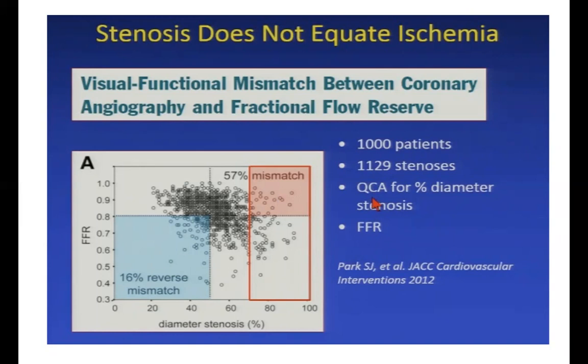How does there become no pressure drop across there? Where does the pressure come from distal to the lesion? Perhaps it's collateral flow in that patient. Who knows? But the measurement indicates you shouldn't put a stent in that patient, even though they have this remarkably high lesion, just using appearance.